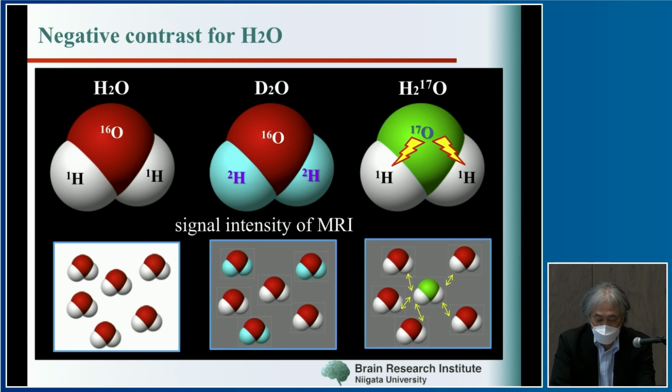In H2 17O MRI, the magnetic resonance signal of 17O allows visualizing and quantifying water dynamics, similar to radioactive ligand used in a PET study. Accordingly, appropriately designed 17O-labeled molecules can be applied in many MRI studies. In this research, using T2-weighted imaging, this can be developed into non-invasive imaging, namely JJVCPE imaging, that is capable of quantifying the content of the target molecules, akin to radioactive tracer imaging such as PET.